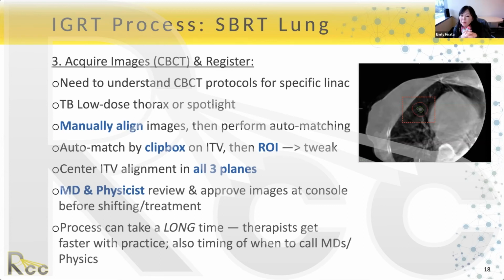And this is also why your immobilization and patient comfort is so important. You don't want your patient to be uncomfortable and having to move, and then you need to re-image all over again.